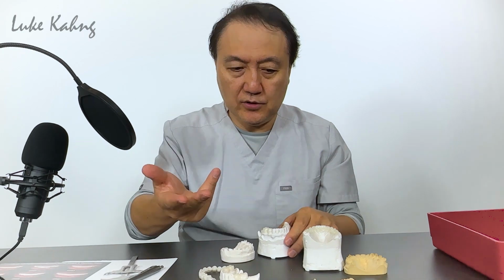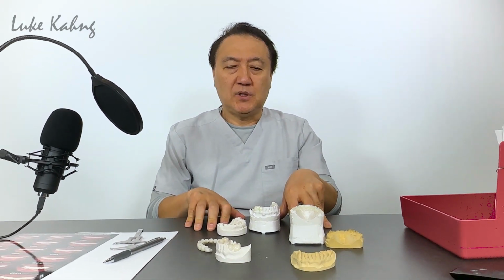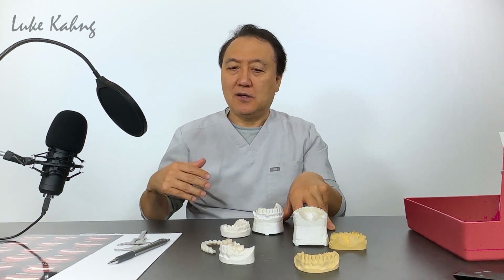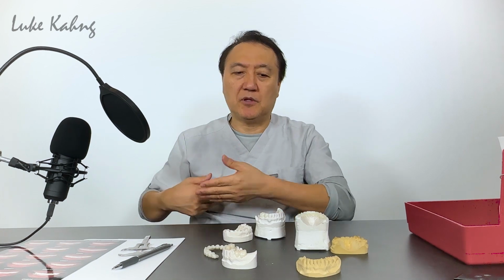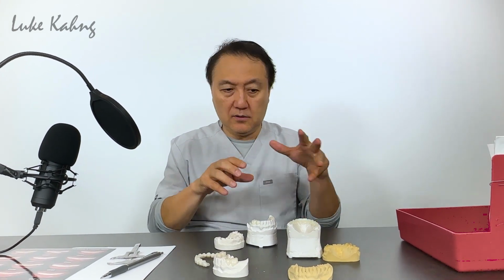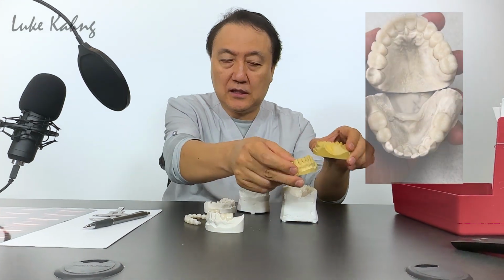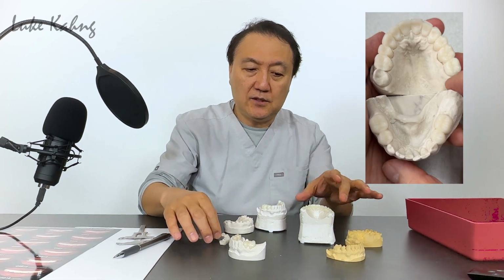Anyways, the reason I show you guys this is that it's a daily case we fabricated, and I'm pretty much a busy guy, so I can look at it. I'm working the cases. I do have a lot of people here, so I give them guidance. Is the mounting right, and then duplicate the model. Okay, from here, the doctor gave it to us, so we duplicate it because of the wax up.